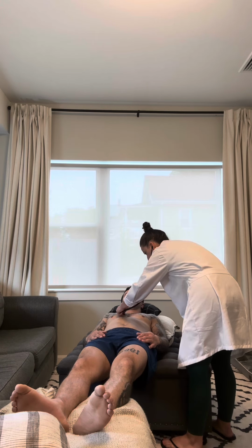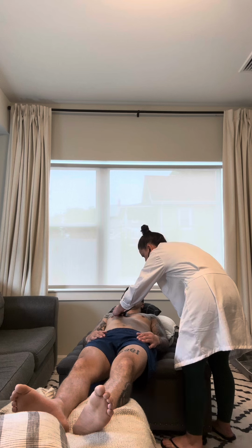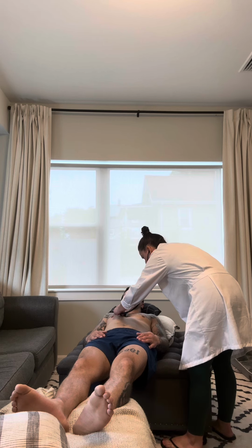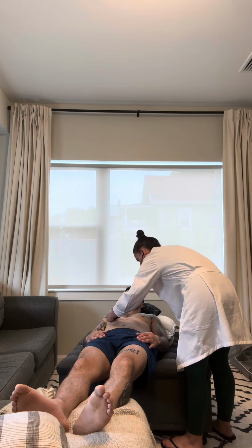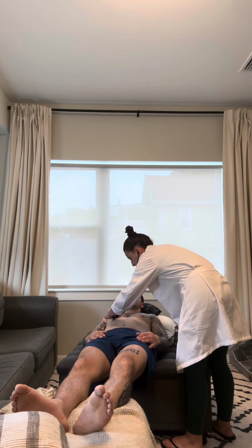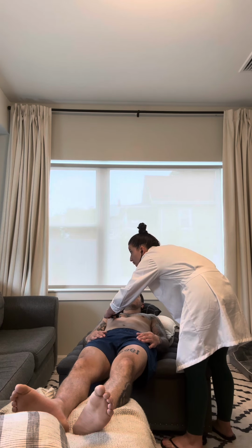And I hear the lub dub. I'm going to go to the fourth intercostal space so I can hear his tricuspid valve. Good, I hear the opening and closing. We're going to move on to his fifth intercostal space. I'm trying to hear the mitral valve, and I do hear it, and that is at the midclavicular line. Very good.